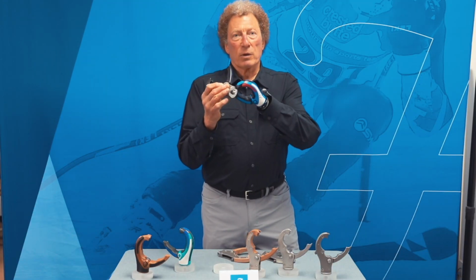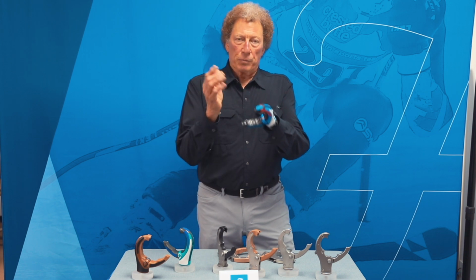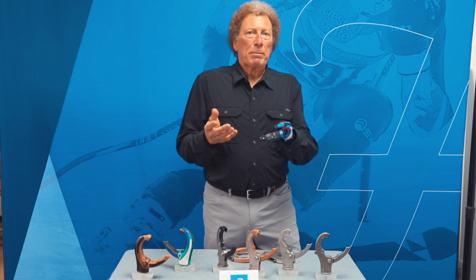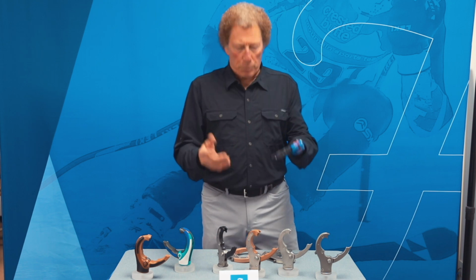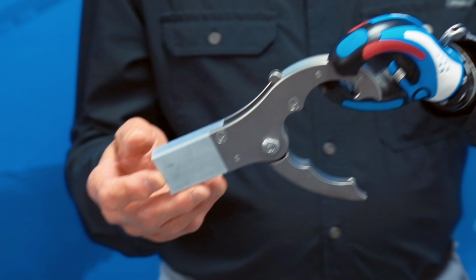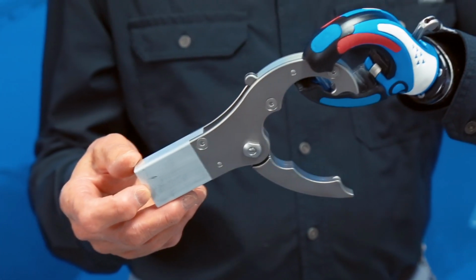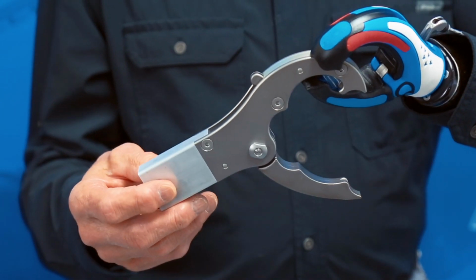The downside of having a wide wrist plate is that you cannot accommodate a flexion wrist, and it's not very applicable to trying to work into a partial hand prosthesis. So if you're building a partial hand prosthesis, we can actually sell you a specialized component that you can shape, drill, machine however you want, so that it can be mounted right to a partial hand prosthesis.